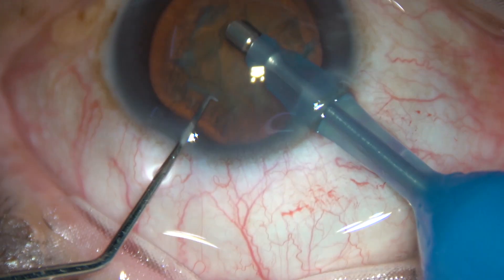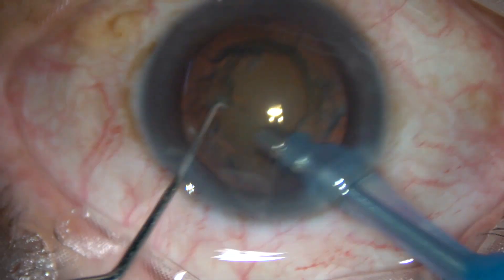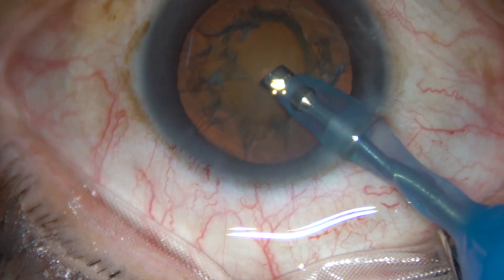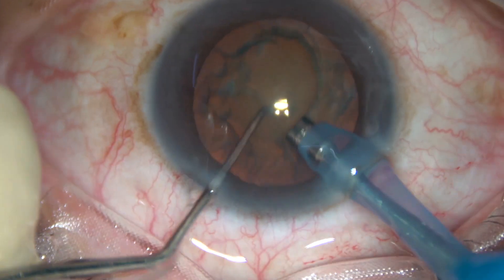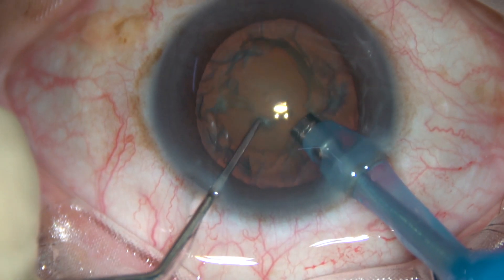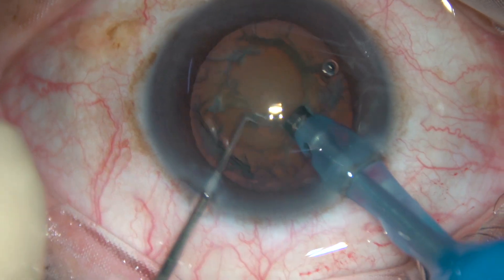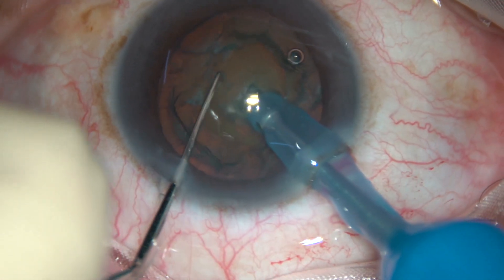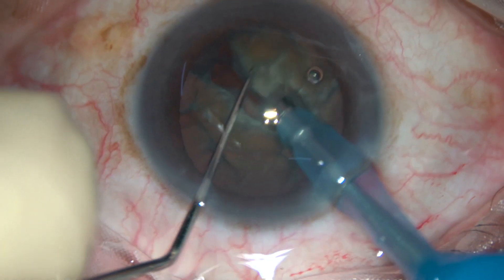Here it is. First clean the superficial cortex to improve visibility, and now hold this nucleus firmly and place the chopper just in front of the main incision and chop it.